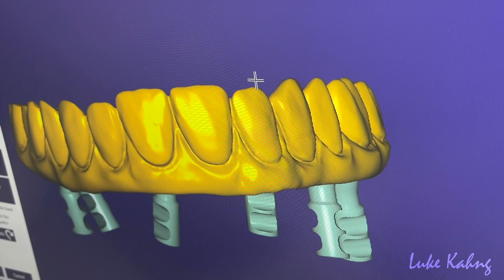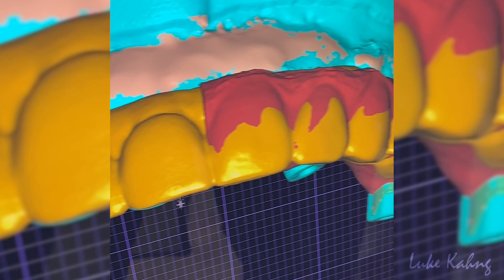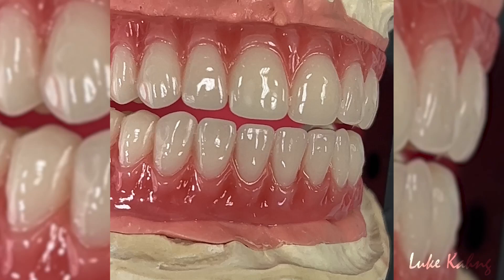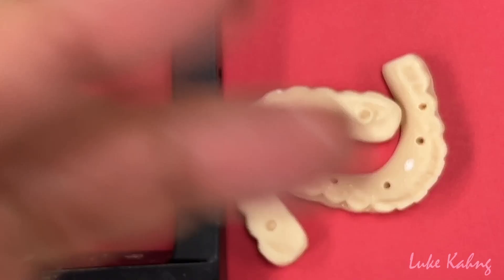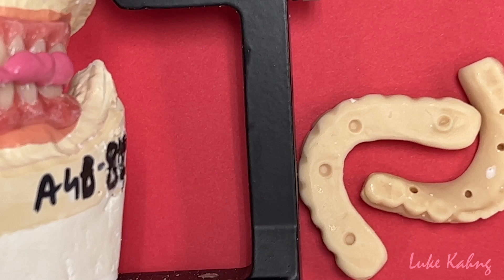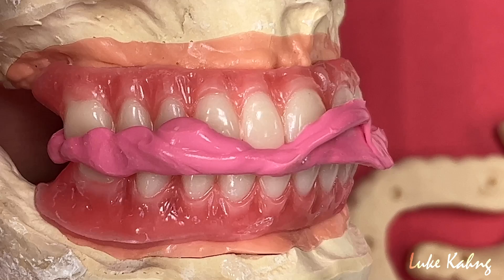We fabricated the wax try-in. The doctor gave us a 360-degree intraoral scan from the STL file as a guide, and we fabricated the wax-up from that STL file. We gave them one shot — we eliminated the verification jig — so we fabricated it and the doctor tried it in the patient's mouth with our wax try-in.